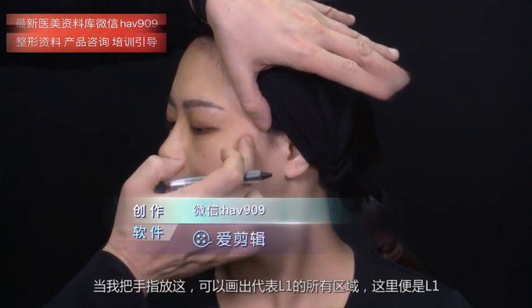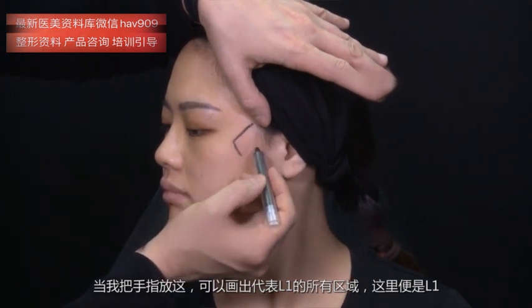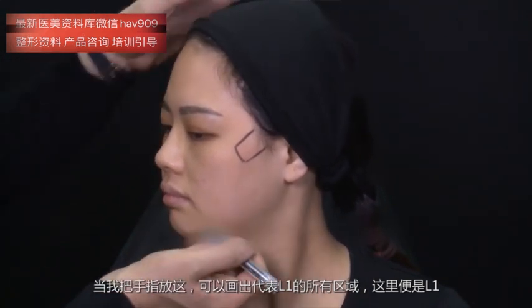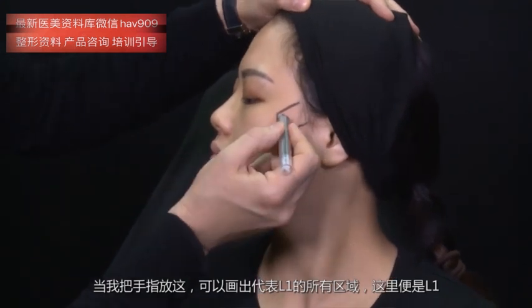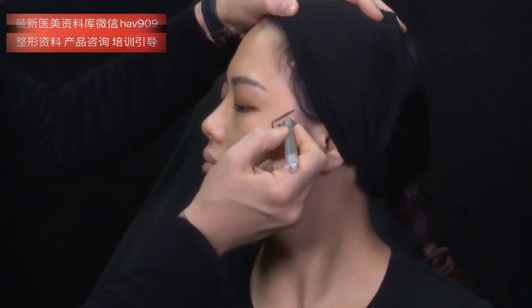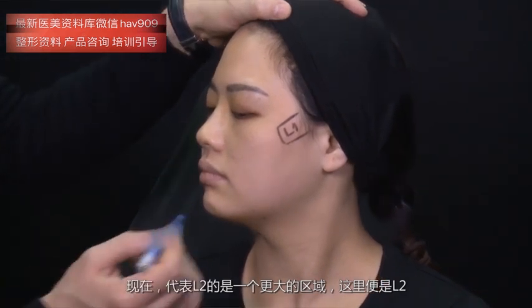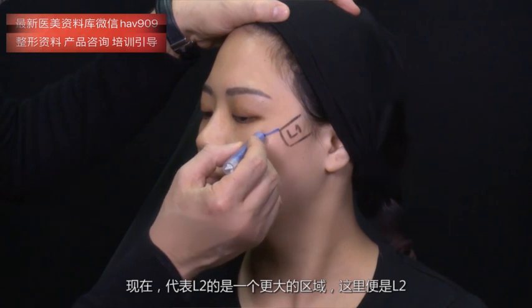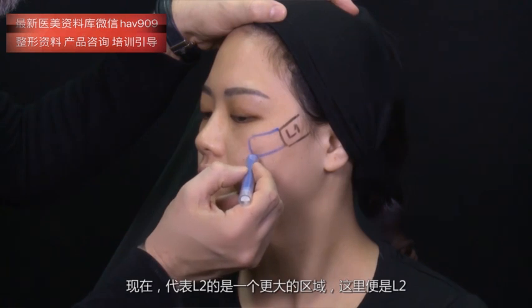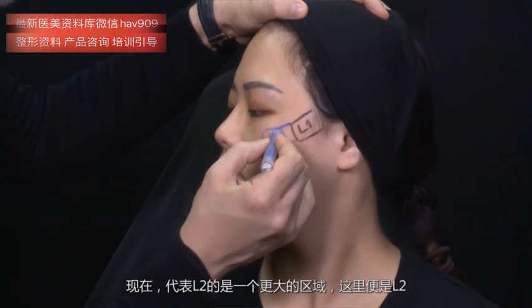When I put my finger, I can draw all the region that is represented by L1. So, this is L1. Now, the position represented by L2 is a much larger area, and this is area L2.